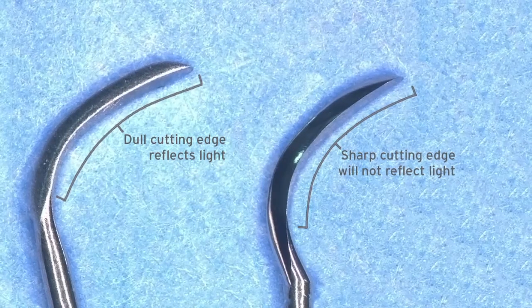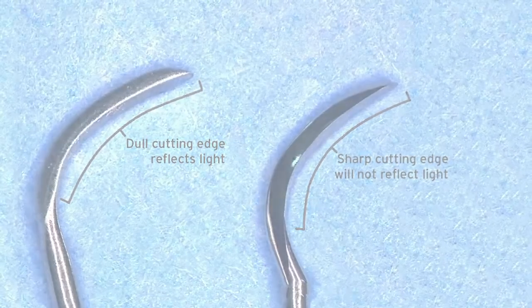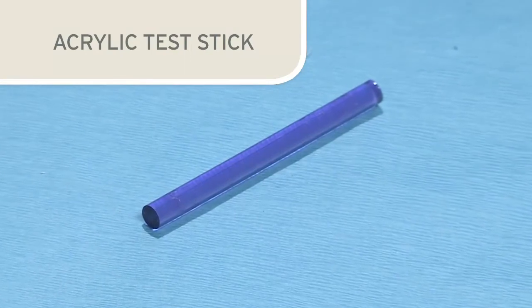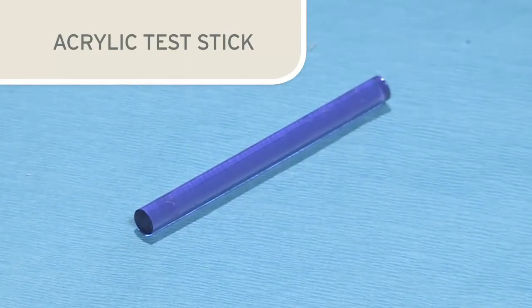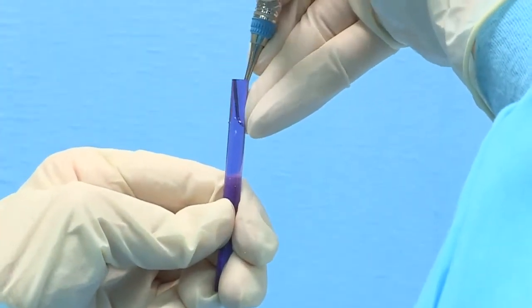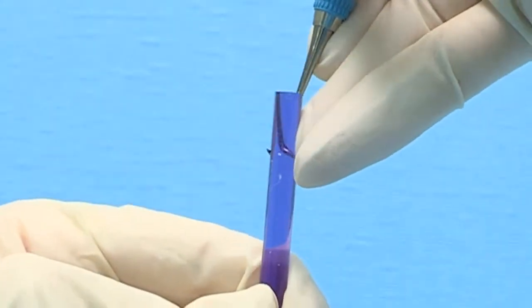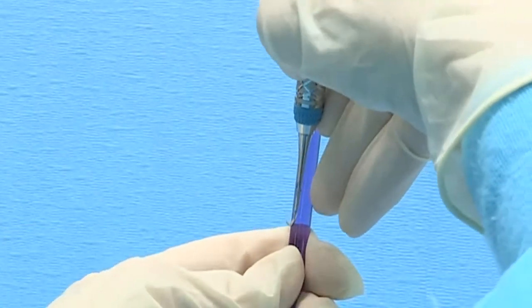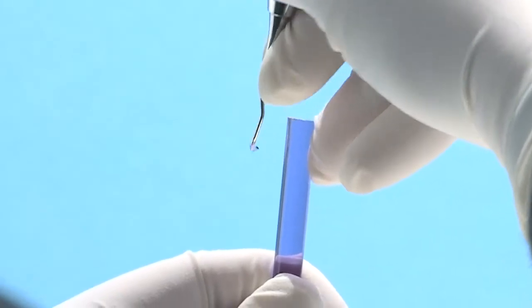It is helpful to use loops or a magnifying lens when inspecting instruments for signs of dullness. A hard acrylic or plastic test stick can also be used to determine the sharpness of the instrument. When the proper testing procedure is followed, a sharp blade will grab or bite the surface of the plastic test stick, and the clinician will also hear a ping or metallic clicking sound. A dull blade will slide over the surface of the plastic test stick.